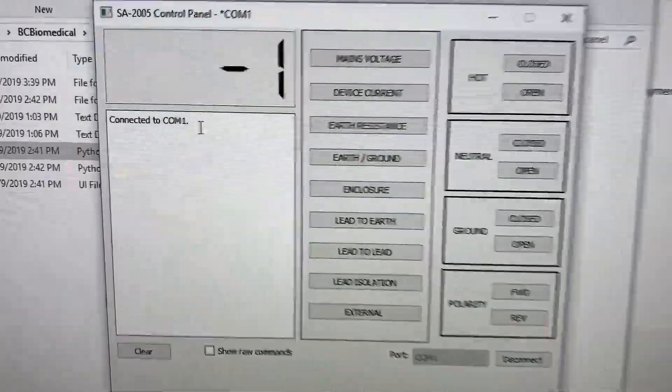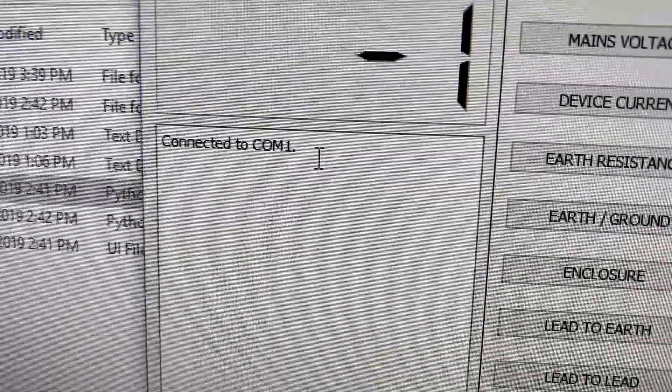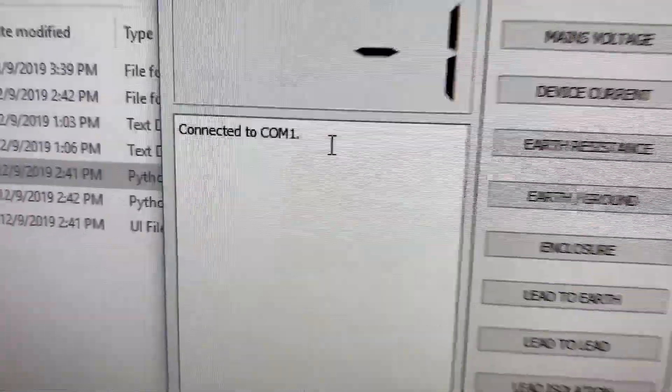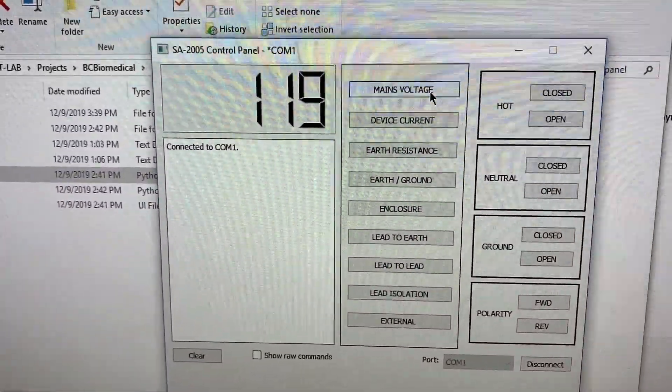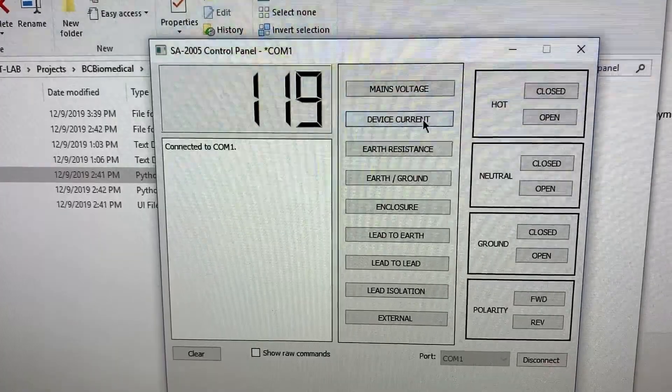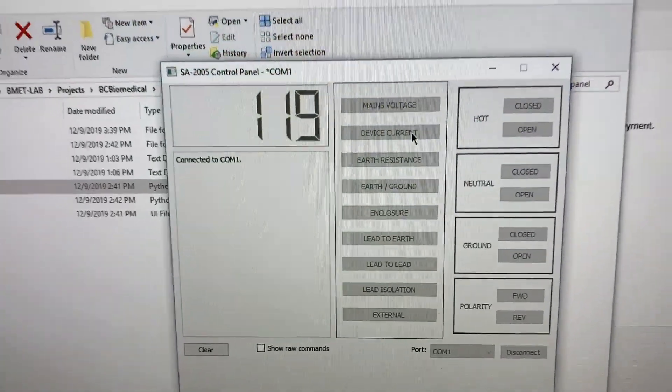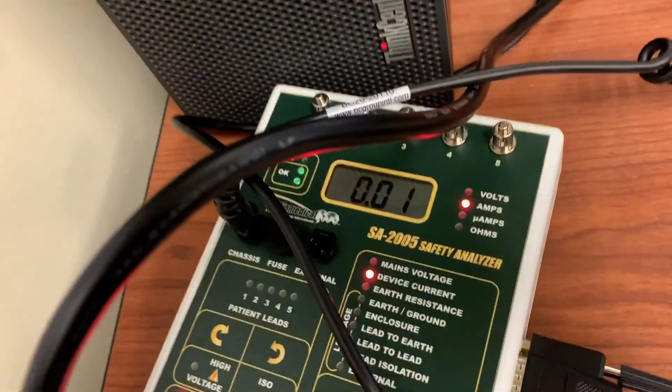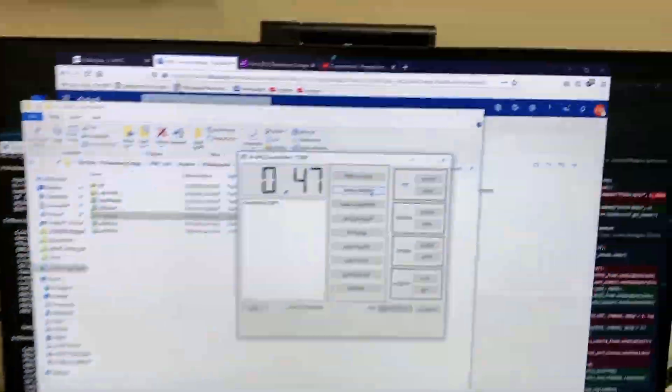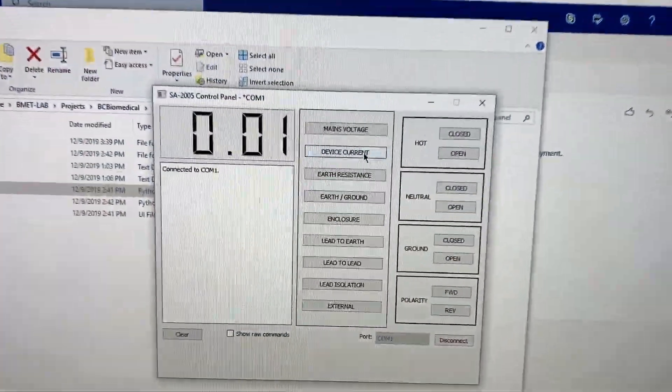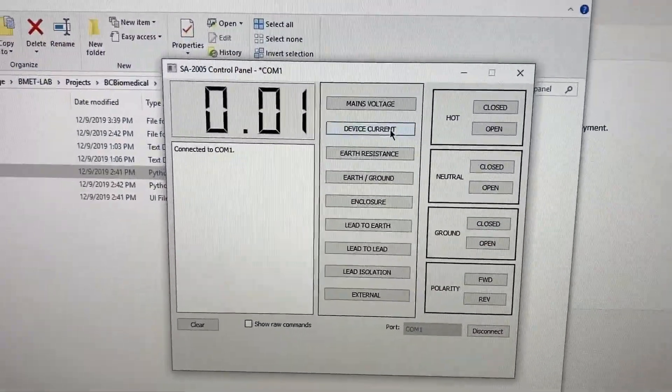And from there it will start pulling in values directly from the machine itself. I can then use these buttons to change the measurement readings, which will also be reflected on the device itself.